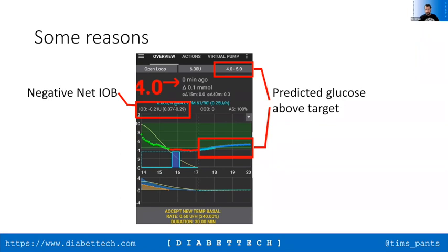And then to review what your settings are and to figure out whether actually maybe, and I'm assuming you're running OpenAPS with auto-tune automated on it? Yeah. So the other thing I would do is delete or rename the auto-tune folder, and then create a new auto-tune folder and start auto-tune again from scratch with wherever you're at the moment, because it does sound as though your settings are probably not in quite the right place.